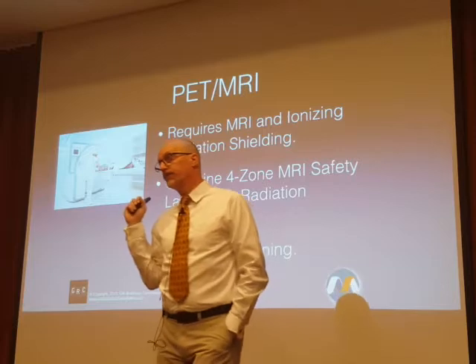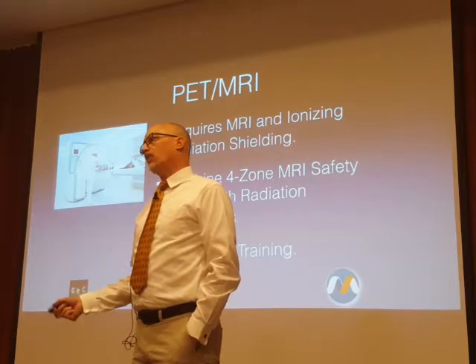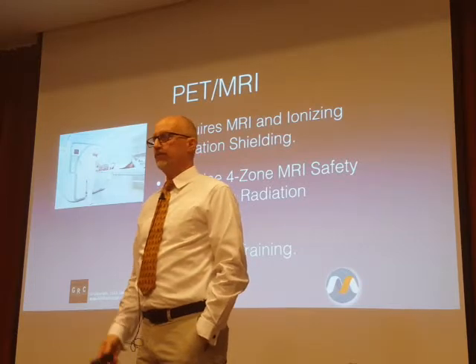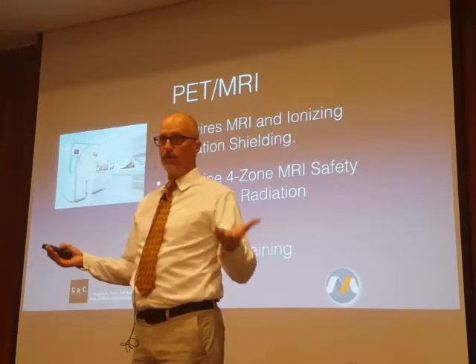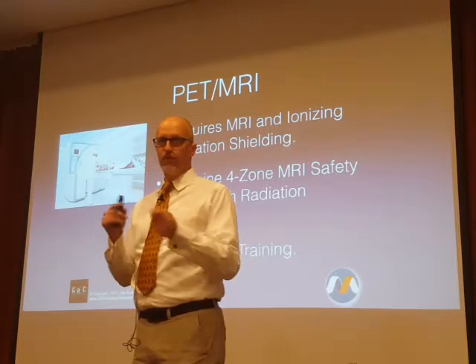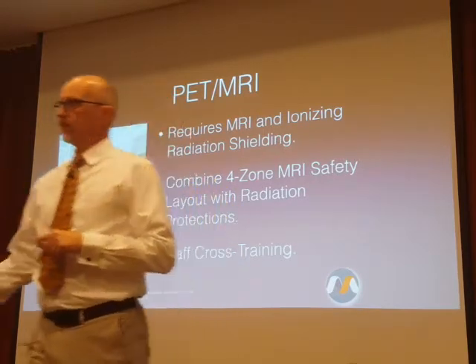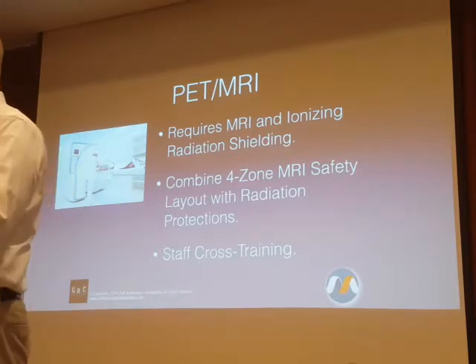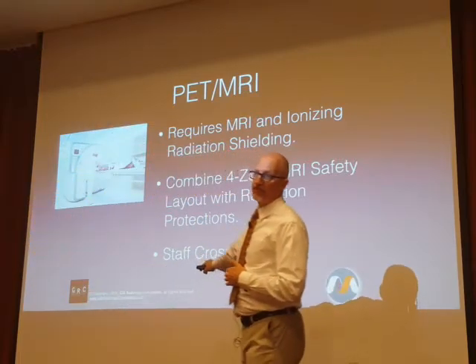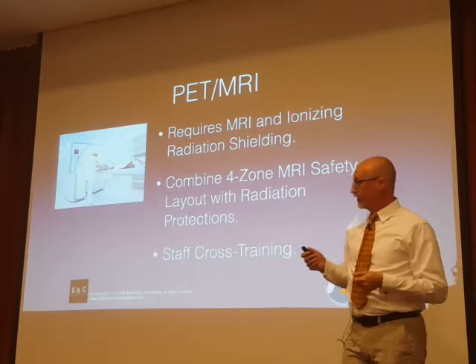Also, cross-training of radiographer staff. Nuclear medicine and MRI are very different professional paths. So do you have 2 radiographers sitting side by side, a nuclear medicine technologist and an MR technologist? Or do you cross-train and you give nuclear medicine skills to your MR radiographers or vice versa? So from a staffing standpoint, making sure that you maintain competencies, clinical and operational from a safety standpoint, that becomes a challenge.